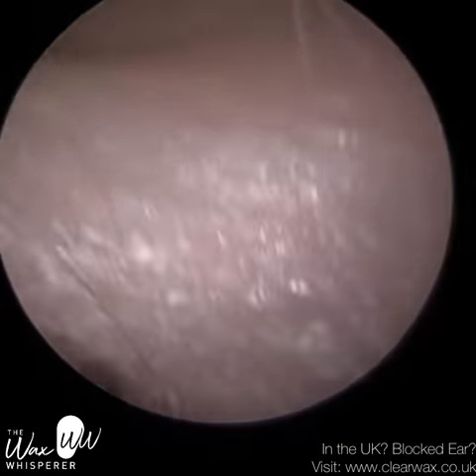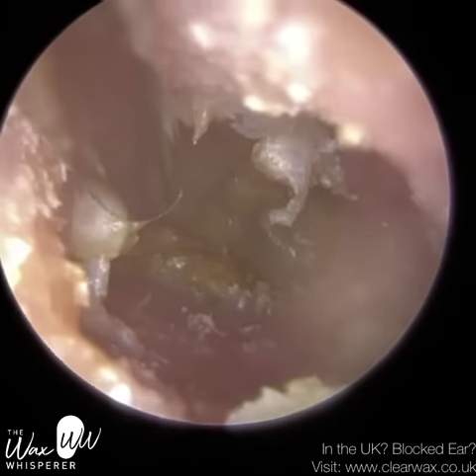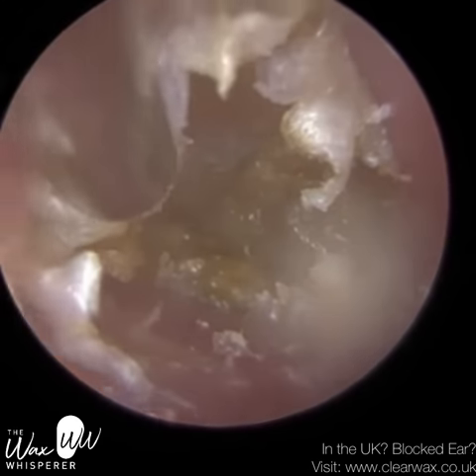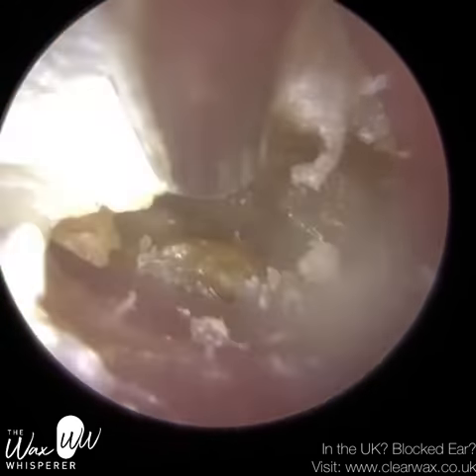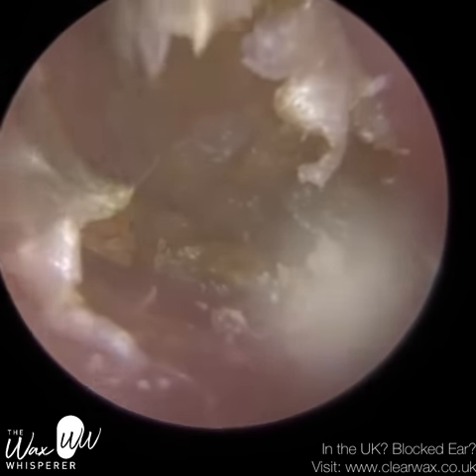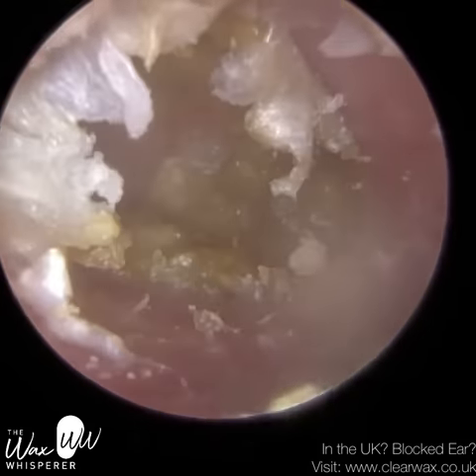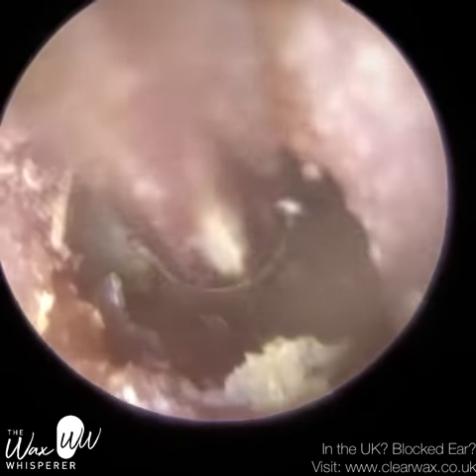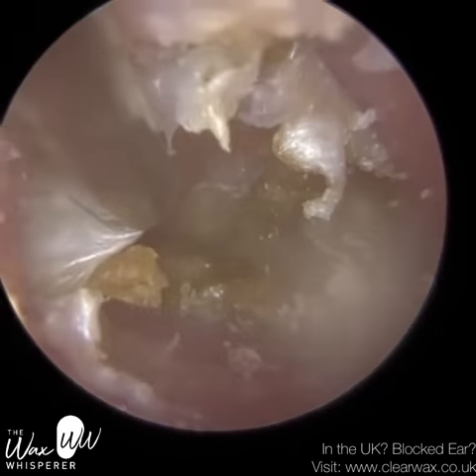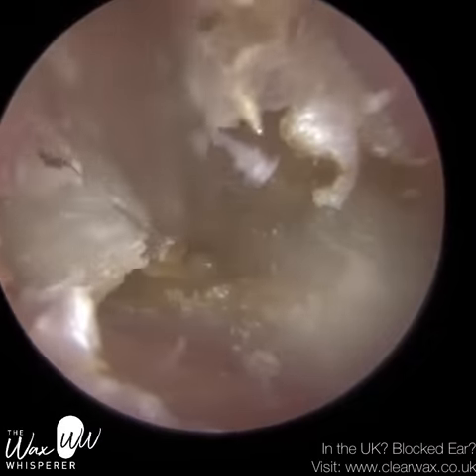I'm just working at the top of the ear canal — you can see some dead skin, a sheet of dead skin. I'm just trying to peel that away but the skin is really adhesive. You can see how much swelling there is. Probably the best analogy of the sensation is: imagine you have some really sticky sellotape stuck on a piece of paper and you're trying to peel it away without tearing the paper. It's similar — obviously a bit more difficult than that, but it's the best analogy I can give to give some perspective of what we're trying to do inside the ear.